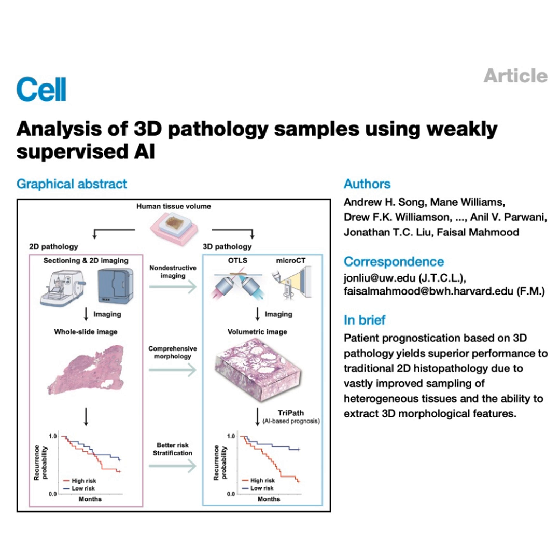Okay, let's unpack this sampling bias thing a bit more. Yeah. I get the concept, but pathologists are trained to target the worst-looking area, right? So how can looking at the whole thing automatically be that much better than a really targeted slice? Doesn't that just add noise? That's a great question. And it comes down to just how incredibly complex tissue heterogeneity can be. Targeting often isn't enough. The sources point out that even a targeted 2D slice captures just a tiny, tiny fraction of all the shapes and structures in there.